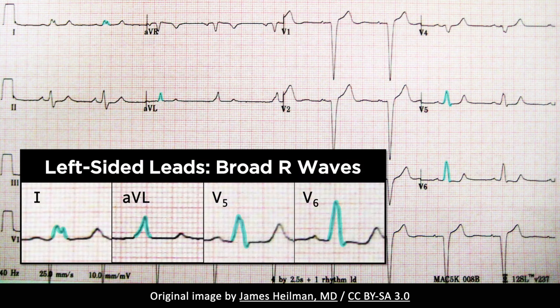The morphology of QRS complexes can also provide important clues. The QRS complexes in left-sided leads have a large positive deflection, which can be monophasic or have a notch. However, if Q waves are present in leads I, V5, and V6, then consider the possibility of myocardial ischemia or infarction.